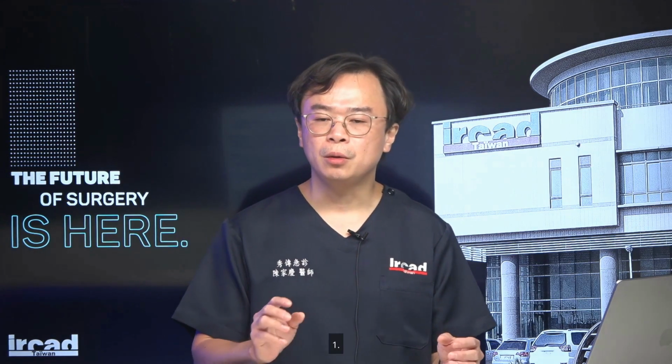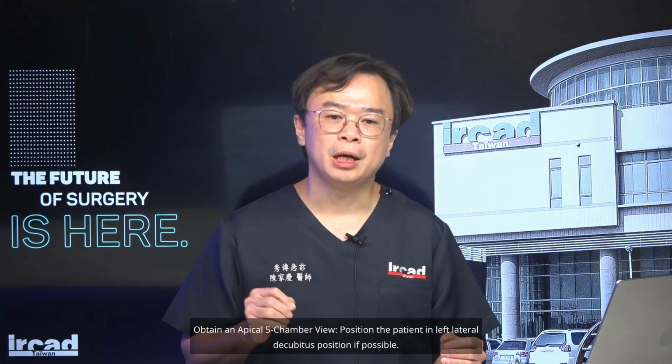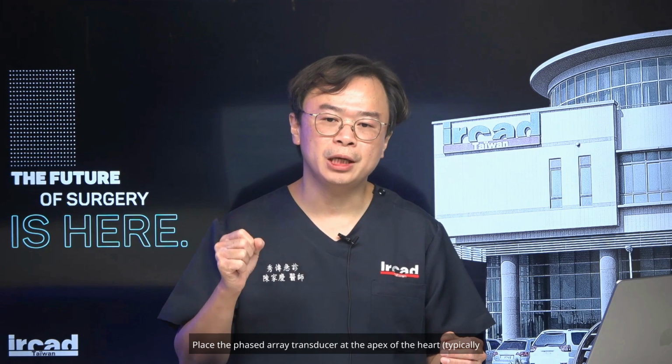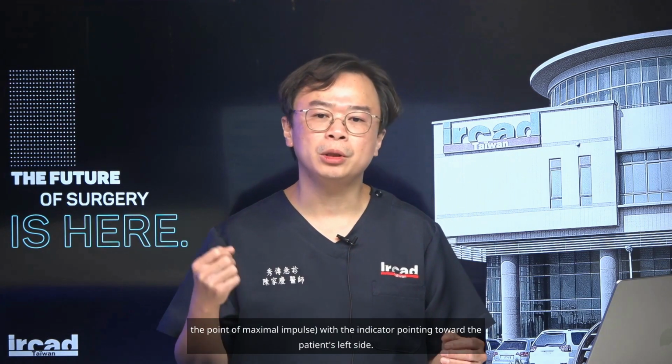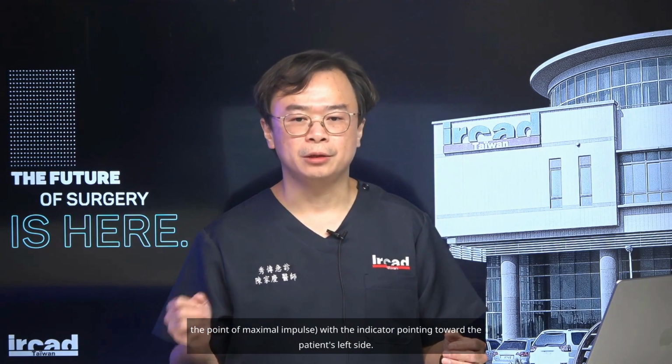Locating and measuring LVOT VTI under ultrasound. To accurately measure LVOT VTI, follow these steps. 1. Obtain an apical 5-chamber view. Position the patient in left lateral decubitus position if possible. Place the phased array transducer at the apex of the heart, typically the point of maximal impulse, with the indicator pointing toward the patient's left side.